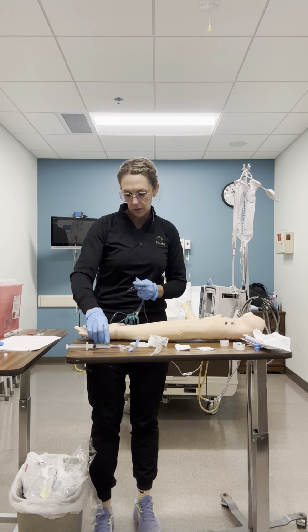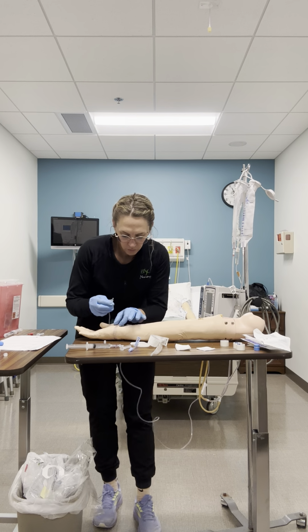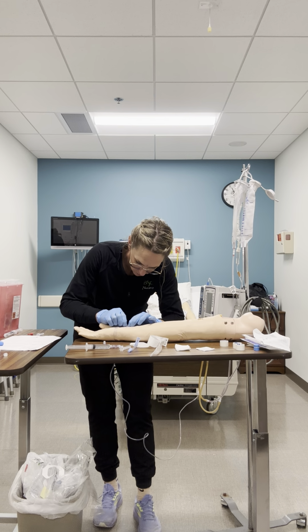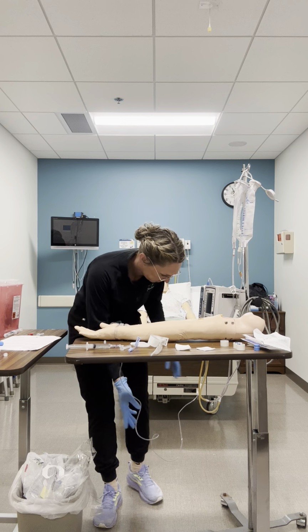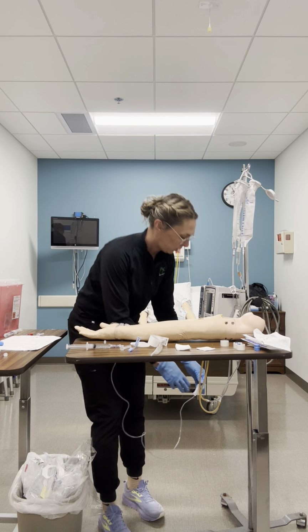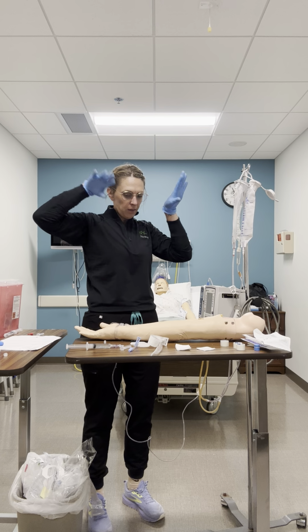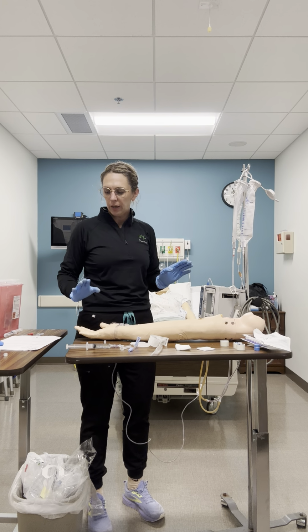We're going to not touch anything. We're going to hook the patient up. And we're going to make sure that the clamps are open. Okay, clamps are open, clamps are open. We're good to go there. Now I'm going to document everything per my facility policy, and that will vary facility to facility. So we'll document the whole thing.